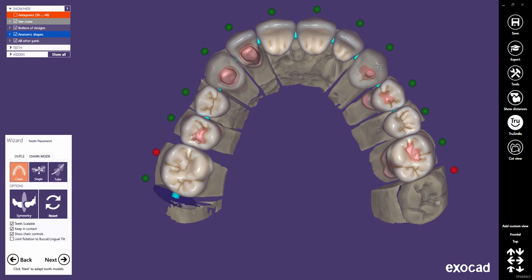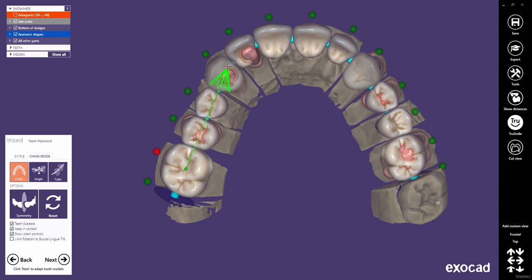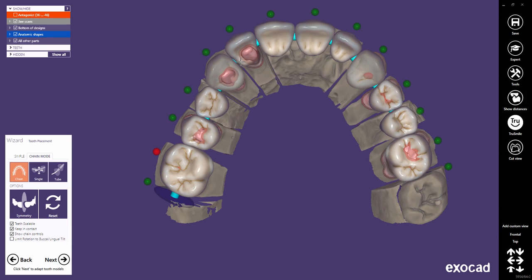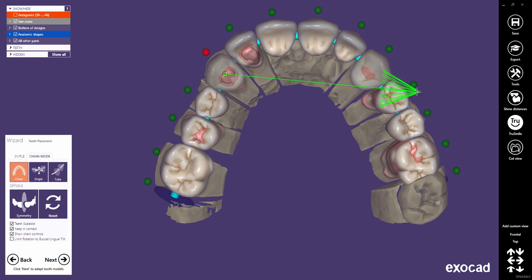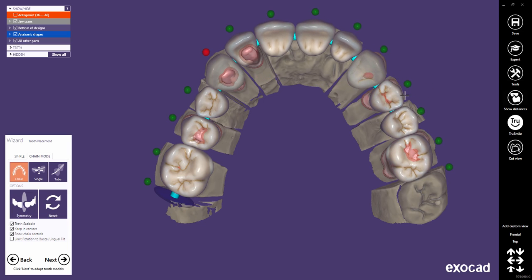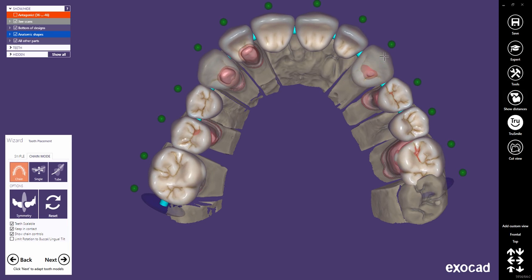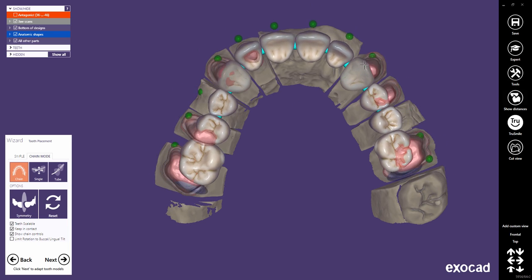Use CTRL, SHIFT, and the left mouse button to scale all unpinned teeth in the buccal-lingual direction. If only one end is pinned, that tooth is used as reference for scaling with SHIFT. If none is pinned, all the teeth will be scaled together with SHIFT.